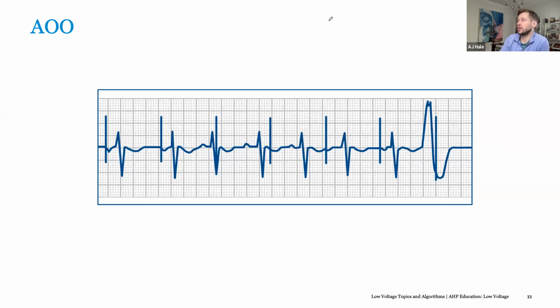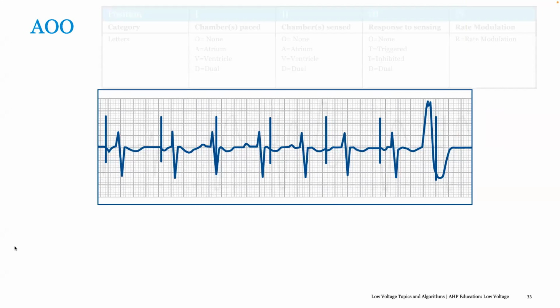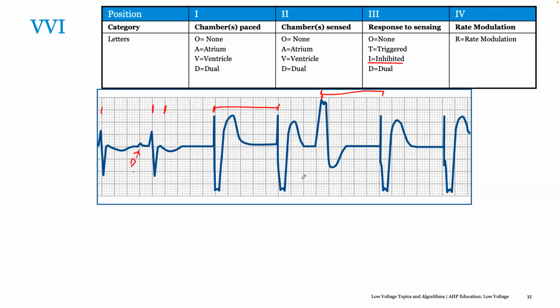Very similar to... Okay, sorry, please. If we go back to the previous slide, there's been this question about the T for the third category, that's the trigger. Usually, we don't see devices programmed that way, I guess. So, can you just throw some light on that T? How does it work? Oh, the trigger pacing here?